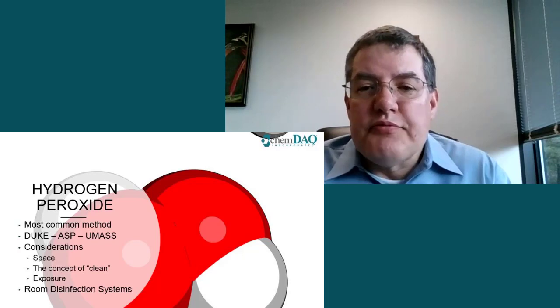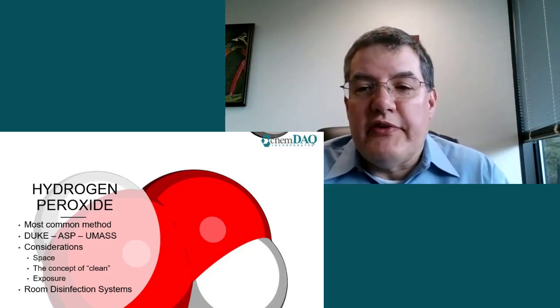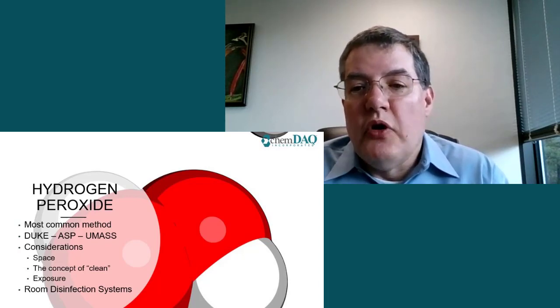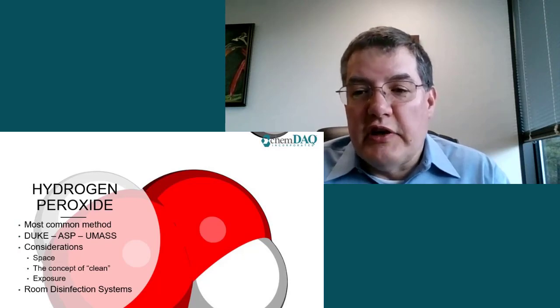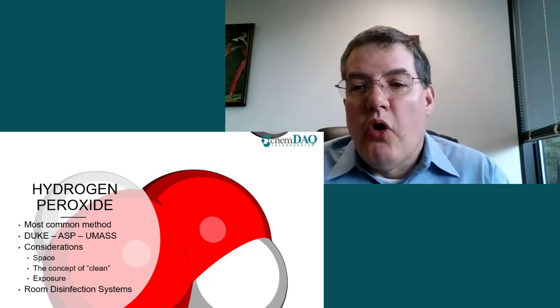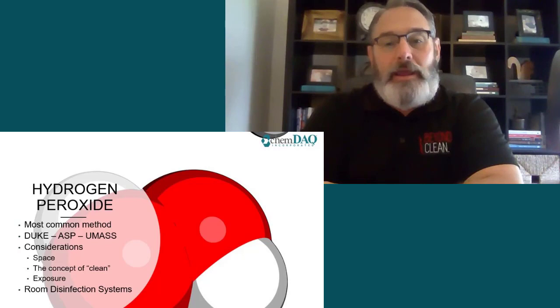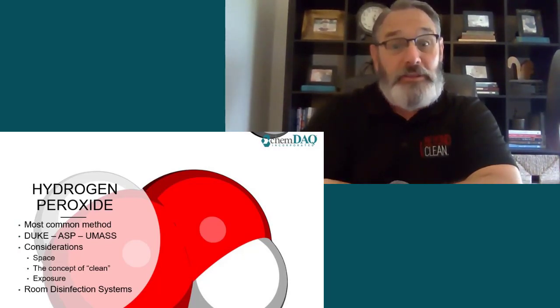In a typical hydrogen peroxide room disinfection system, the device evaporates or mists a known amount of hydrogen peroxide, calculated based on the volume of the room or the chamber and the desired concentration. Hydrogen peroxide is then left for a dwell period during which the disinfection process occurs. It is then removed by drawing it through a hydrogen peroxide scrubber or vented outside. So while this emerging technology is great, it brings huge challenges to mind for me, space being the first.